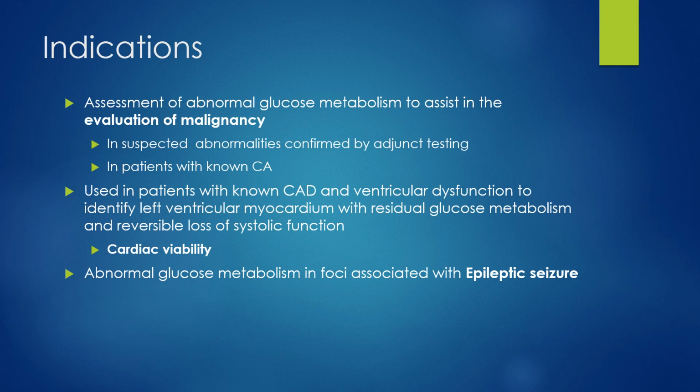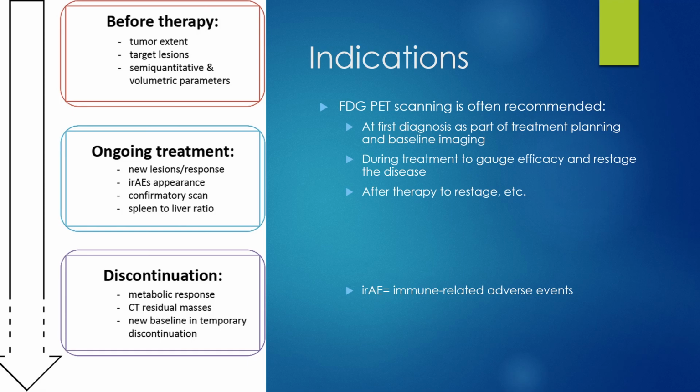This is also known as cardiac viability. That will be discussed in a later presentation. This one is just focusing on oncologic uses of FDG.